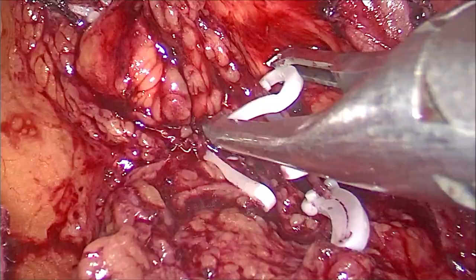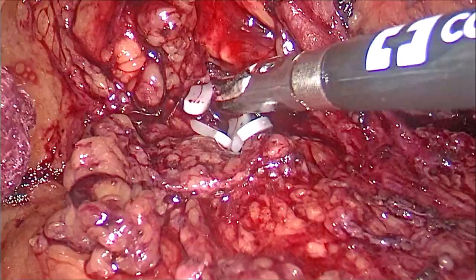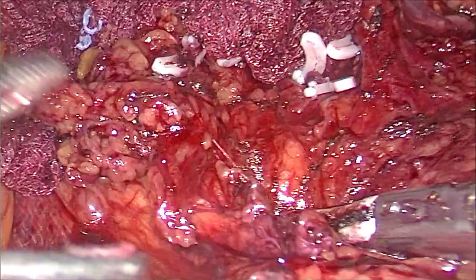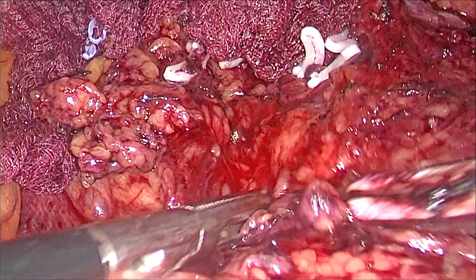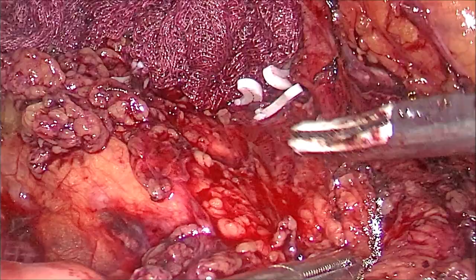This step can also be done from above after taking down the gastrocolic ligament, but since it was easy we did it from below. We will be seeing this again once we take down the gastrocolic ligament attachments. Once this is done, the next step is to go along the SMV on its right border to identify the right colic vessels and the ileocolic vessels and then divide them.